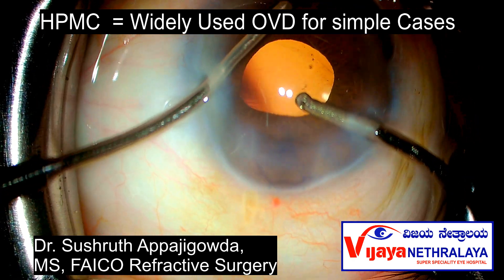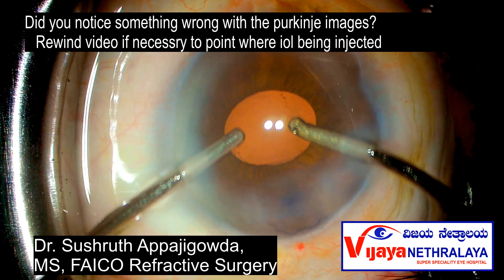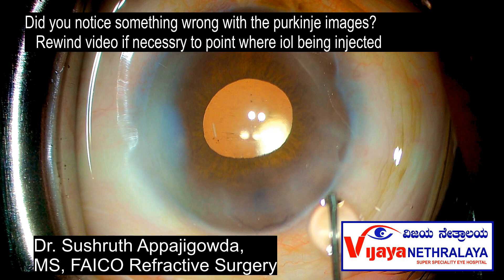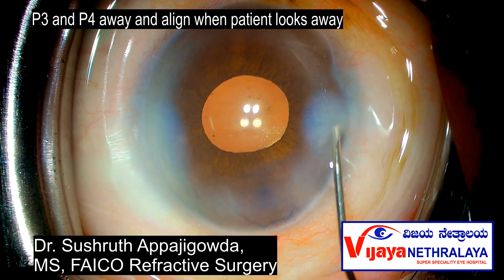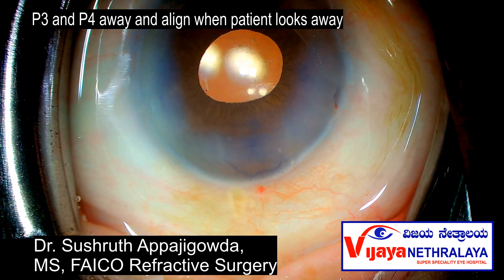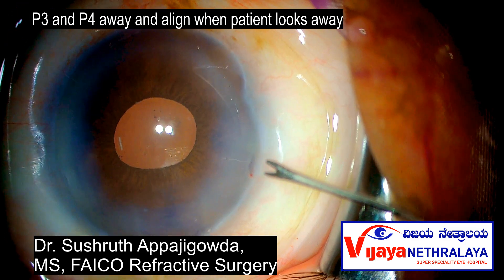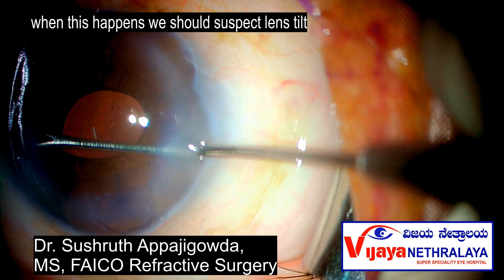Getting back to our main topic — did you notice something wrong with our Purkinje images? P3 and P4 are not seen when the eye is aligned or kept perpendicular to the microscope. This is the left eye of the patient. I am sitting at 180 degrees, chasing the steep axis, and when the patient looks away, all three Purkinje images align — and that's a bad sign. Ideally, when the eye is perfectly aligned to the light source, all the Purkinje images should be seen.